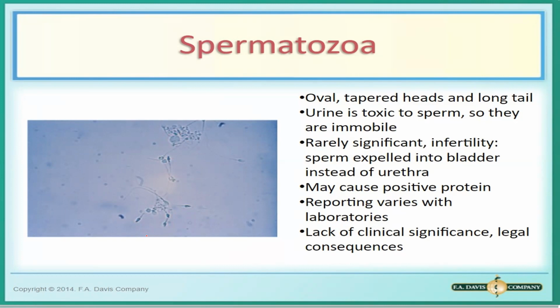Okay? It depends po sa purpose of your urinalysis. Kasi if you're detecting for male infertility or retrograde ejaculation, of course, you will need to report yung inyong spermatozoa. So, alam nyo naman siguro yung infertility, ano yung retrograde ejaculation? Yung retrograde ejaculation po is, you can see it, wala lang akong photo ng anatomy ng males.